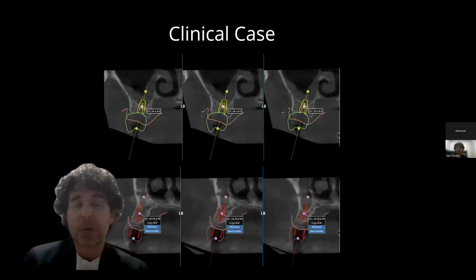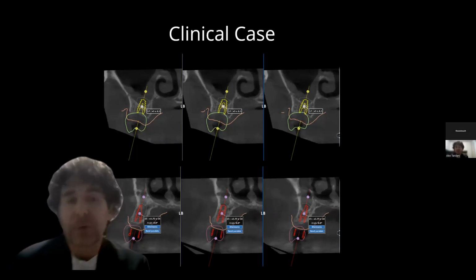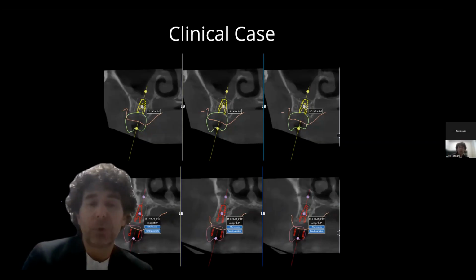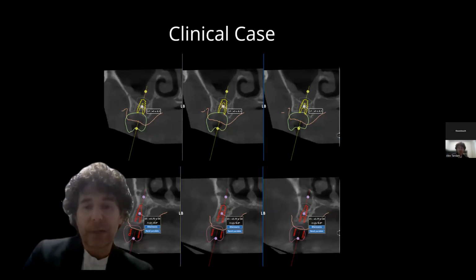At the same time, you don't see it here because to simplify things for tonight's webinar, I didn't include all the images, but you can see how this maxillary sinus shows a thickening of the membranes, which was evaluated, and then we saw radiographically. You will also see that this is due to an endodontic problem on one of the 2 teeth we will remove later on. So where did the mallet help us here?